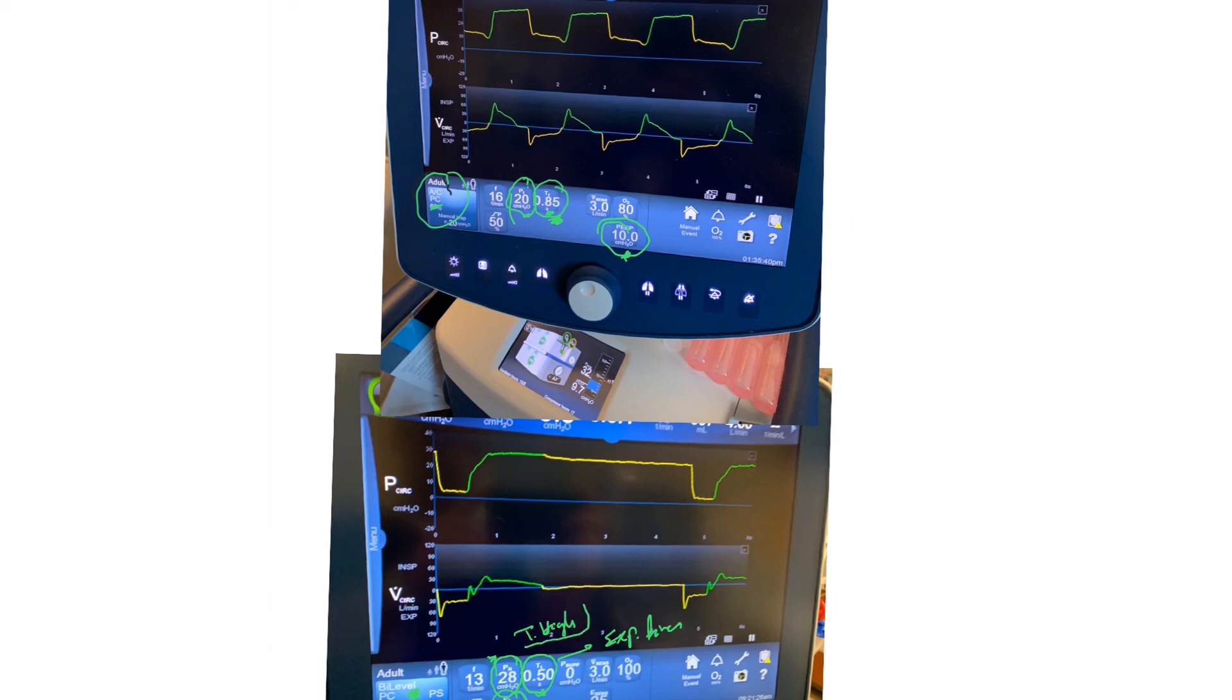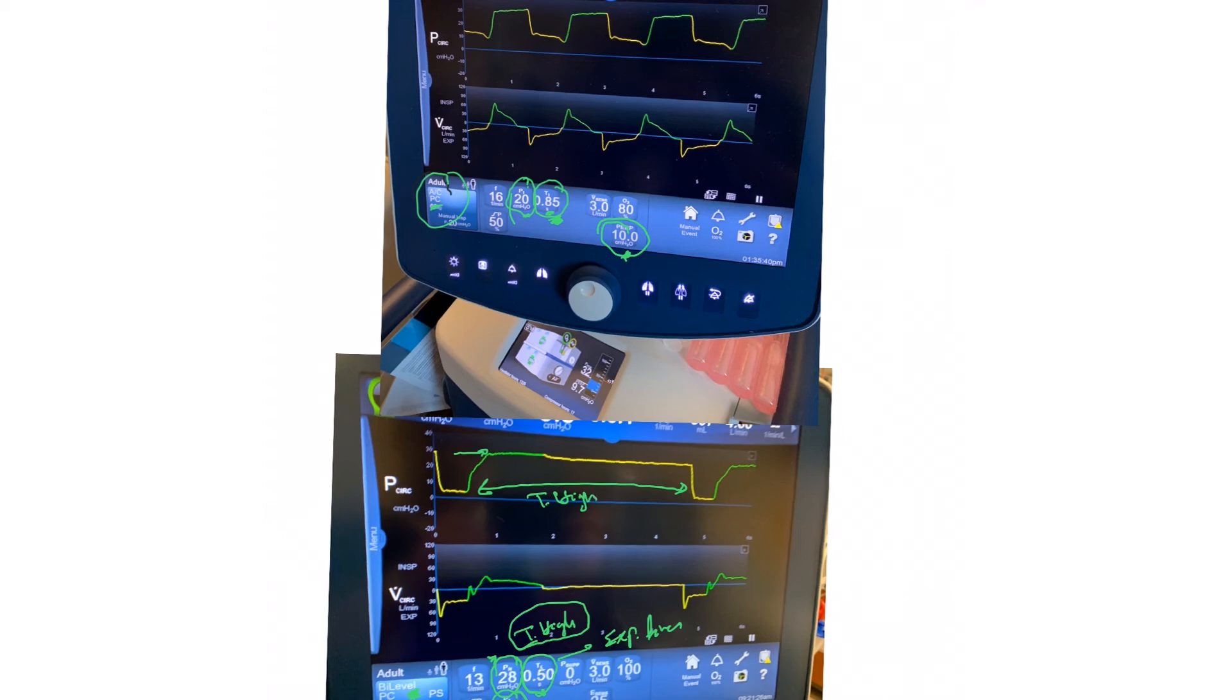The ventilator will keep this pressure high—the 28 here—for a specific period of time called T high. See this? This is the T high. We're keeping this pressure for this period of time, that's called T high. Then we release the valve to drop the pressure to drop to the P low or the PEEP.